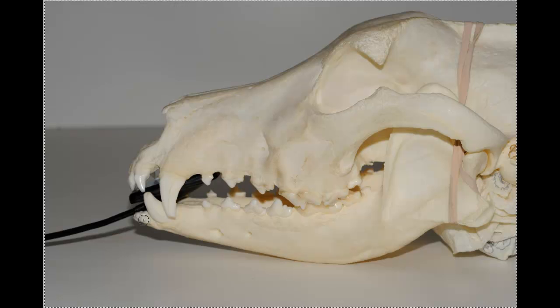The incisors, the mandibular incisors on shepherds and labs tend to be relatively flat, like you can see here, whereas the maxillary incisors have a steeper angle, like so. Just seems to be the case with boxers and pit bulls that their mandibular incisors are much closer to the same angle as the upper incisors, but not so the case on shepherds and labs and so forth. So here we have the sensor at about that angle, the front teeth at about that angle.